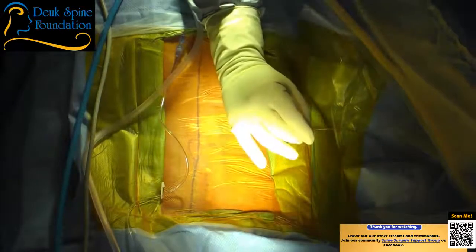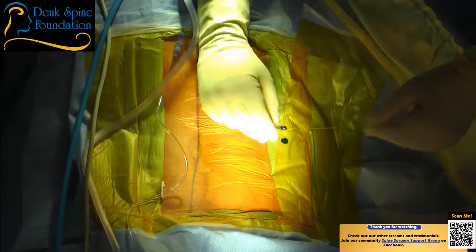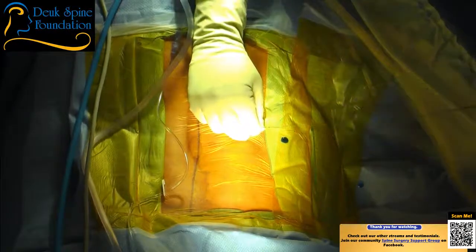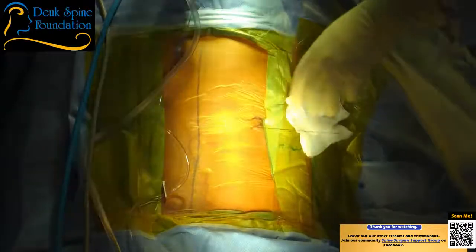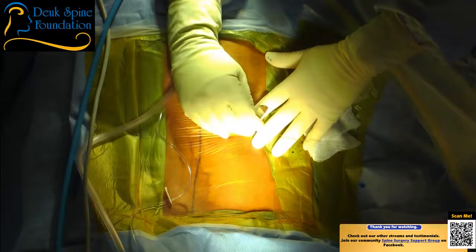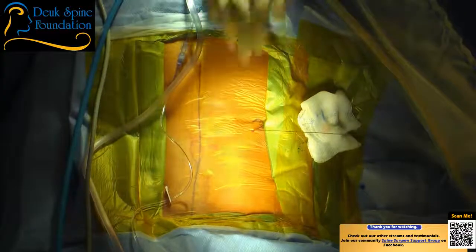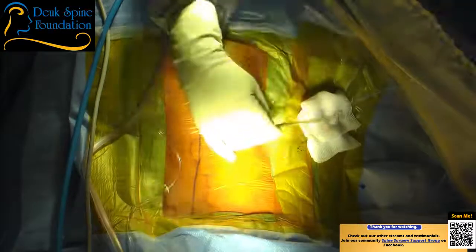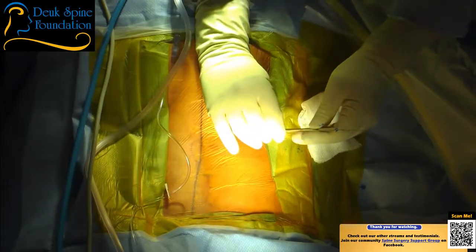On the lateral view I've got my guide wire in and I'm taking my spinal needle out. We found the bad disc and we're going to fix it. We're going to make a seven-millimeter incision — the entire surgery is done through seven millimeters. This is not percutaneous. A percutaneous procedure is done with a needle. You can't fix a disc with a needle — you actually have to do surgery on the disc.